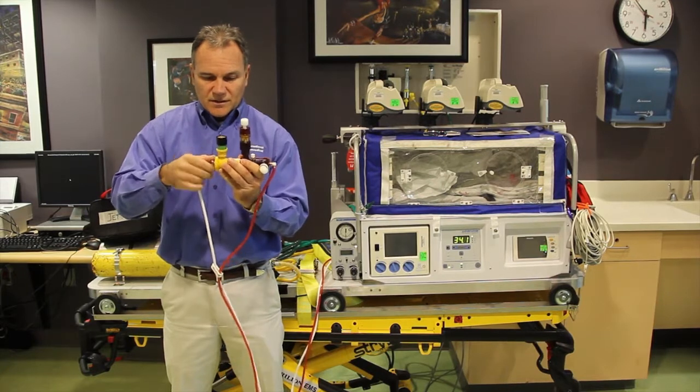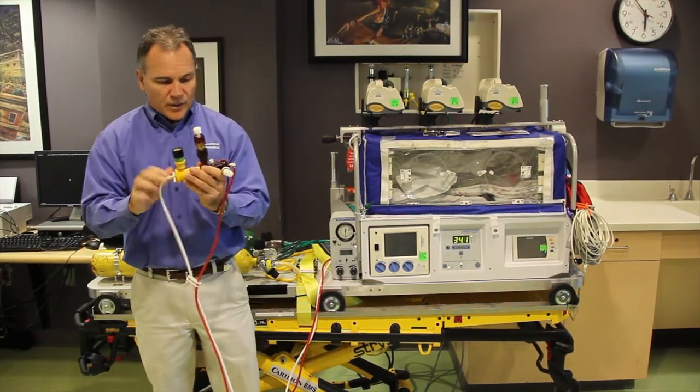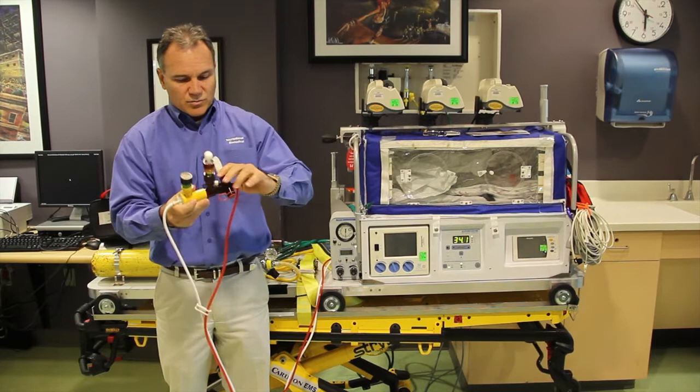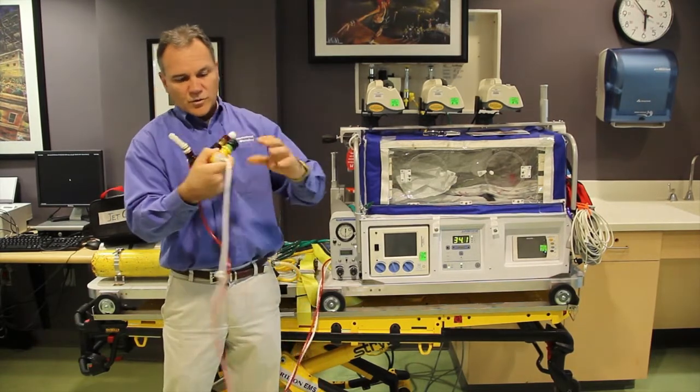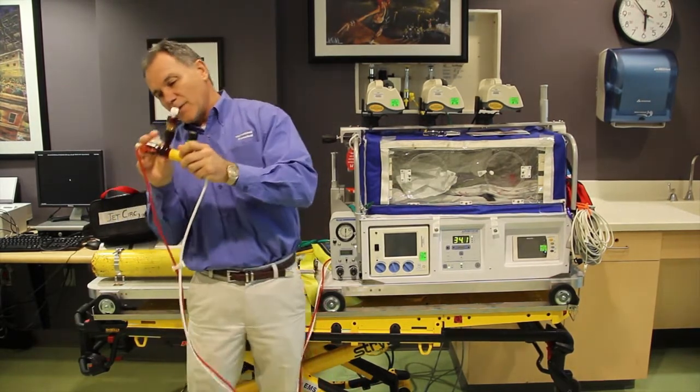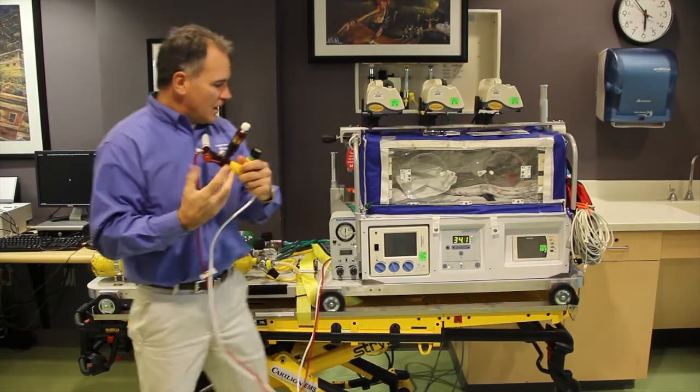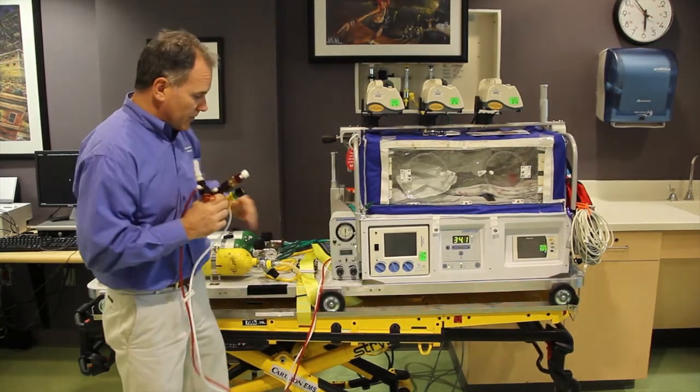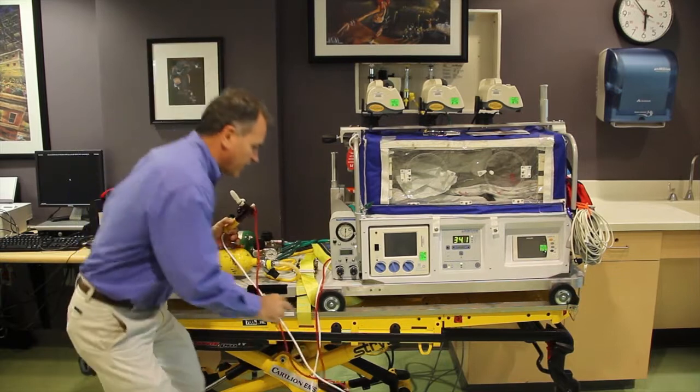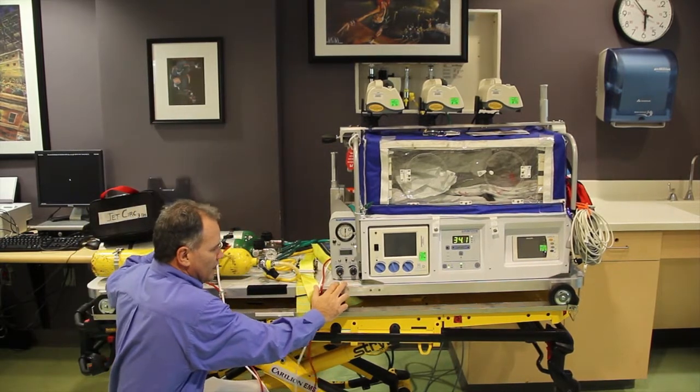I'm going to put this back in and put that into the Phasetron and T on the inspiratory limb. So again, this is the Phasetron. This is where the ET tube will go, normally inside the incubator with the patient right here. I'm going to move on to the TXP ventilator.